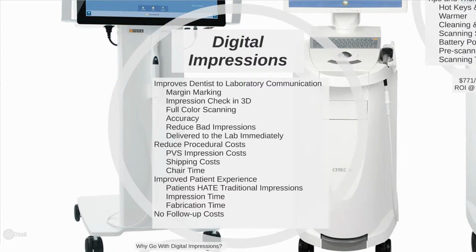It also reduces bad impressions because we're able to look at it on such a big screen. We're able to analyze it right there in real time. Also, it is delivered to the lab immediately, not allowing for it to be set aside or forgotten about in the busy schedules that sometimes offices have.